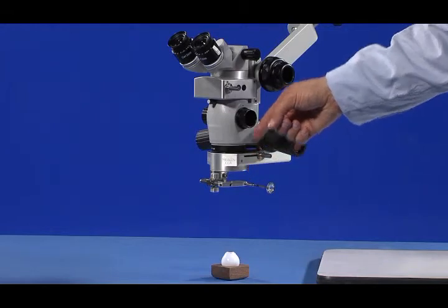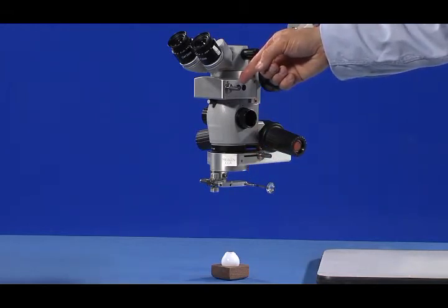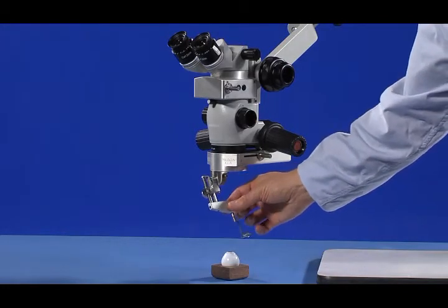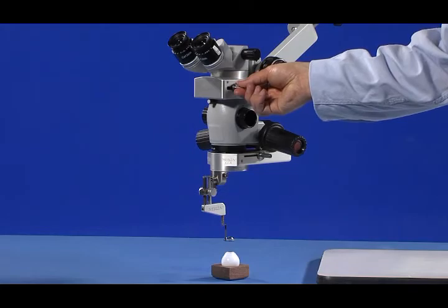As demonstrated in this portion of the instructional videos, the Merlin Surgical System is designed for ease of use with minimum effort, regardless of whether you are using the automated models or the manual models.